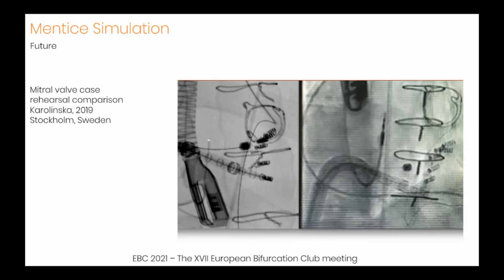Clearly, it helps them to discuss the upcoming procedure in real terms and allows them to more easily identify possible difficulties and complications, and thus be prepared to tackle them during a live operation. Effectively, it has allowed them to streamline the procedural workflow before the patient is even on the table.